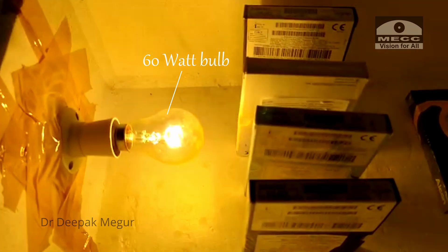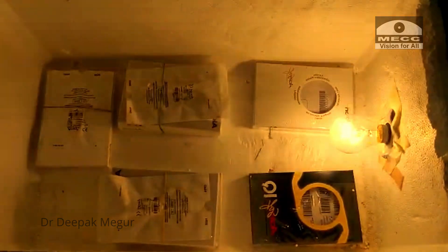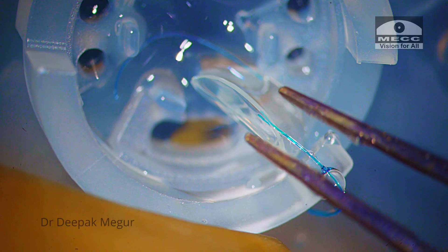We have used a 60-watt filament bulb to warm up the box. However, two 40-watt bulbs on opposite ends would be better, but the 40-watt filament bulbs are difficult to get in the current times.